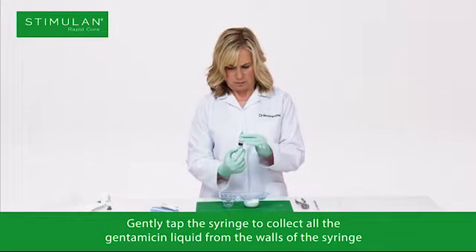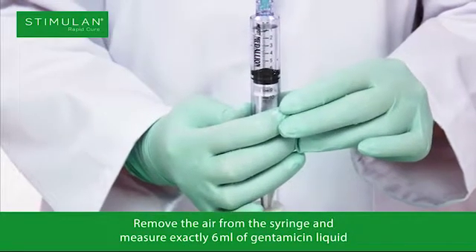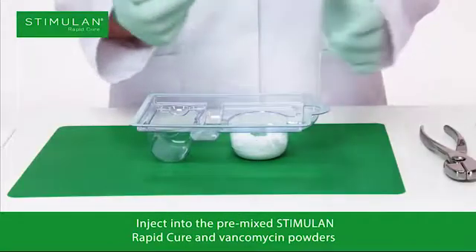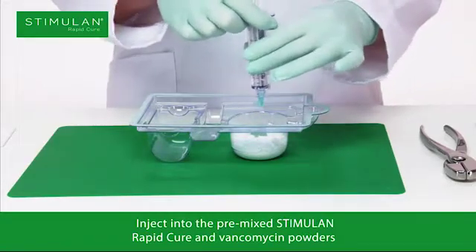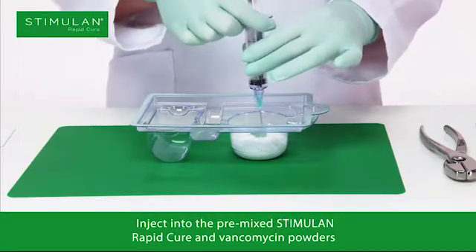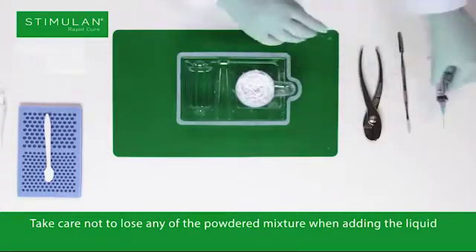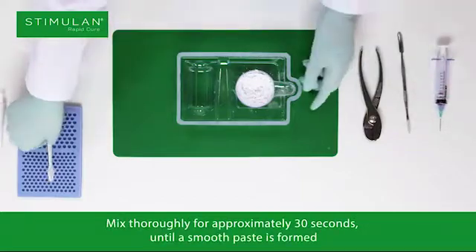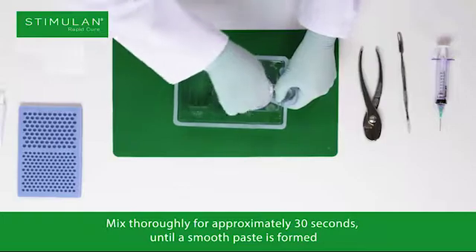Gently tap the syringe to collect all the gentamicin liquid from the walls of the syringe. Remove the air from the syringe and measure exactly 6ml of gentamicin liquid. Inject into the pre-mixed Stimulan Rapid Cure and vancomycin powders. Take care not to lose any of the powdered mixture when adding the liquid.